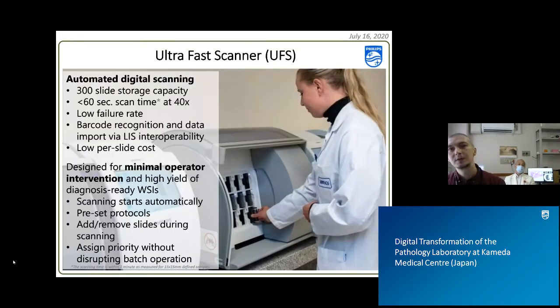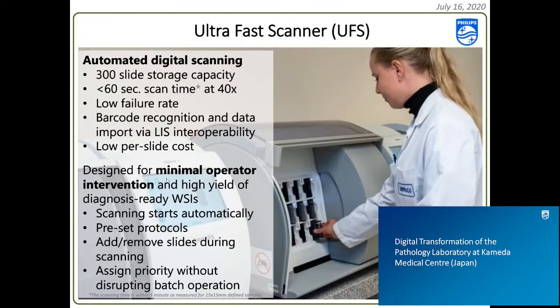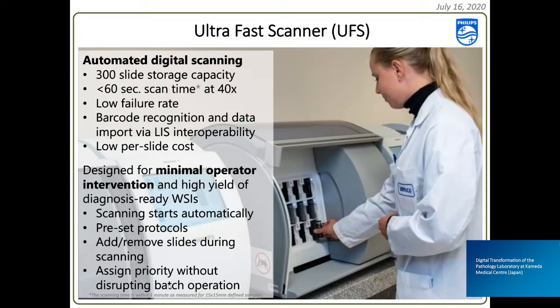But of course, it all started with the scanner. An ultra-fast scanner, which we are using in a daily mode. There are several specifications described here in detail, but most notable for us are a huge slide storage capacity and the fast speed.